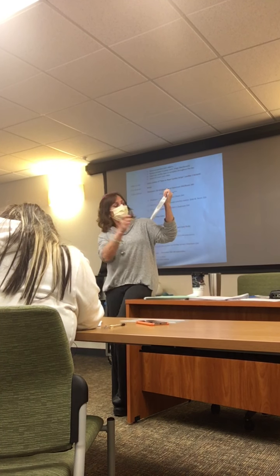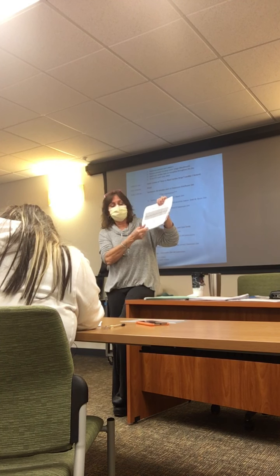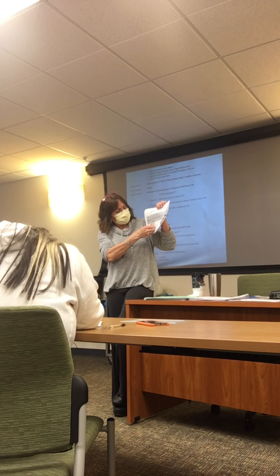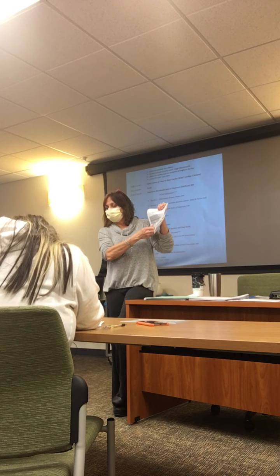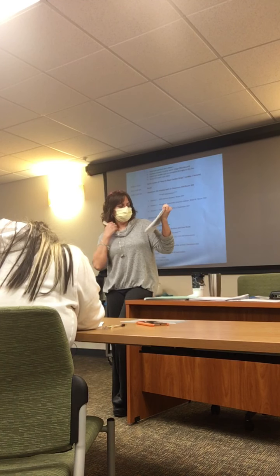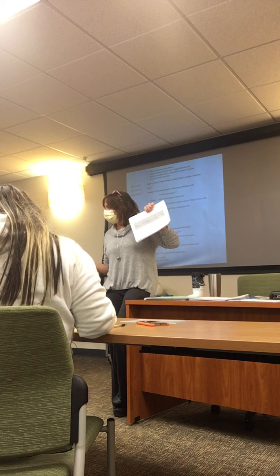So I'm going to take my calipers. I'm going to put it at the beginning of the P wave, and if you forget exactly where that is, go back to the What's My Name page. And then the beginning of the QRS complex. And I'm going to count the number of the little tiny boxes in that PR interval. So how many little tiny boxes are you counting? About 4, 3 or 4.